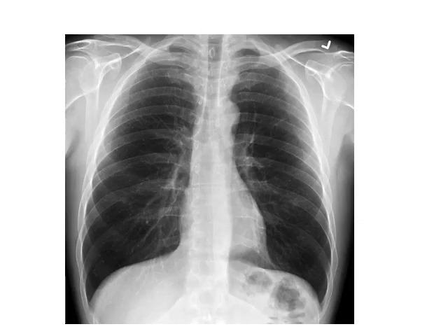Here is a nice, normal, clear chest x-ray. We've got the left side here. You can see the trachea coming down, dividing into the two bronchi — if you look carefully you can see the branches. You can see the vertebrae through here, a nice clavicle that's not broken, the ribs coming across — posterior ribs and anterior ribs. You can see part of the liver and the diaphragm. Down here are parts of the bowels — those dark spots are air or gas bubbles in the bowels.